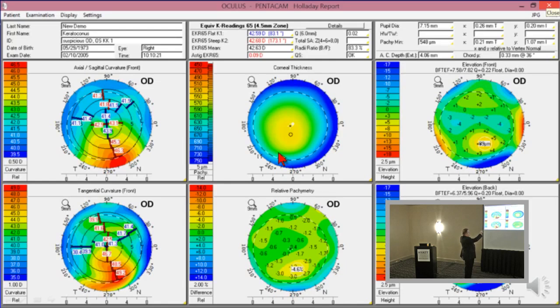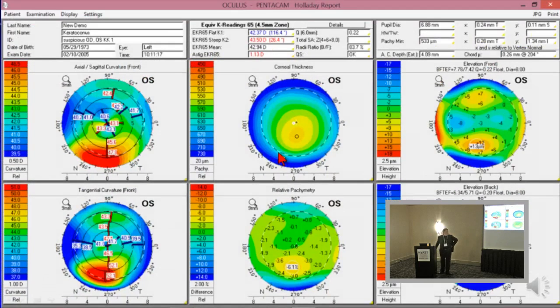All right, so what were the points? The black circle was 1 millimeter, not 2 to 3/10, and I had 2 out of 3 red spots, and of course, the posterior elevation is the most significant. That relative pachymetry was only about 4.5%, just about orange, but the red was that posterior elevation. Okay, any questions about that? Okay. Now here was the other eye.